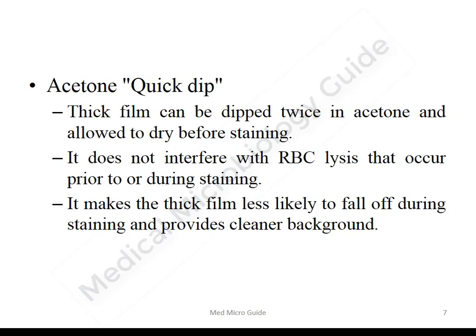We can do a quick acetone dip before de-hemoglobinization or before going for staining. Dipping the thick smear twice into acetone and allowing it to air dry will prevent the thick smear from falling off during the staining procedure, and also provides a clear background for the thick smear.